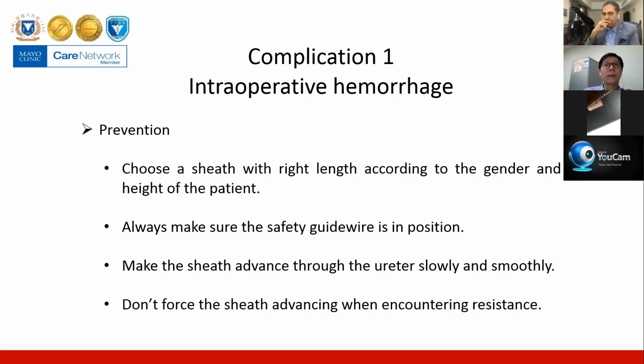And next, when we do lithotripsy with the Holmium laser, clear vision is important for the prevention of injury. Fluent circulation of saline and suitable perfusion pressure is the key factor for clear vision. Then we should avoid injuring the renal pelvic mucosa, especially the neck of the calyx.